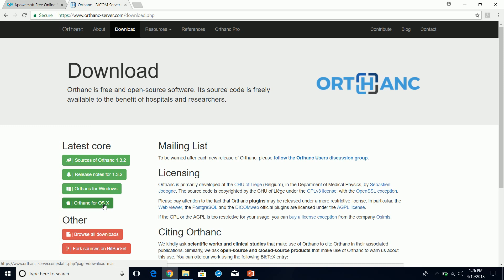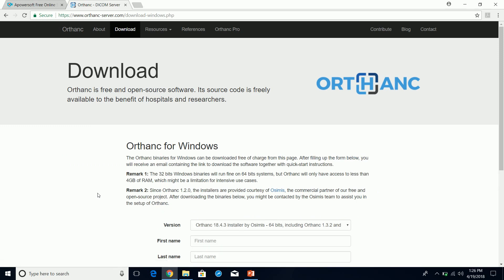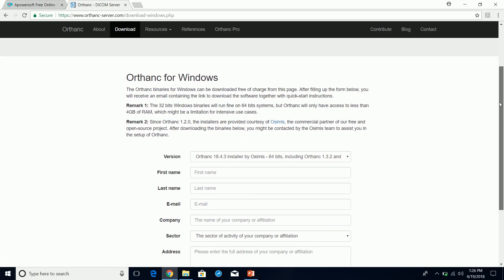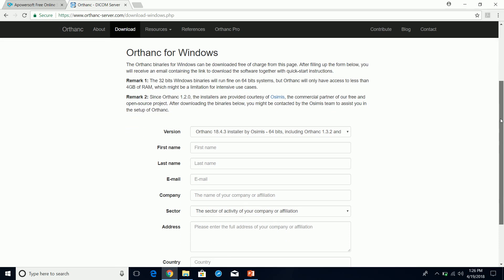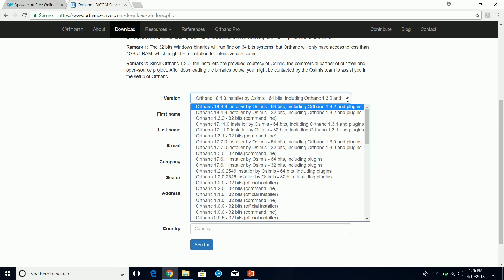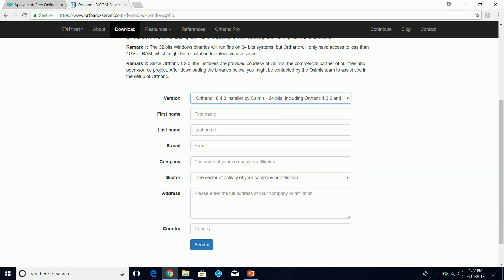We're going to come up here to Orthanc. Depending on whether you have Windows OS or Mac OS X, I have Windows, so I'm going to do Windows. It's going to ask you to fill out some information here so you can download. You can stay with the default - 64-bit is my OS, so we're going to go ahead and fill out this information.